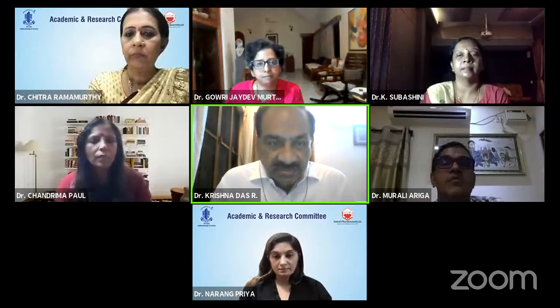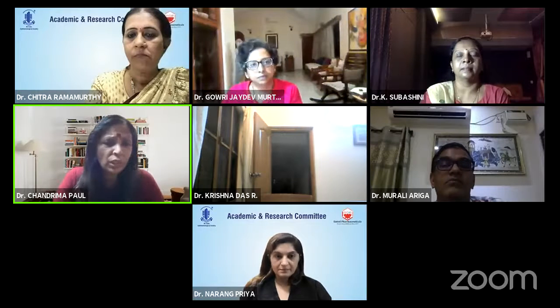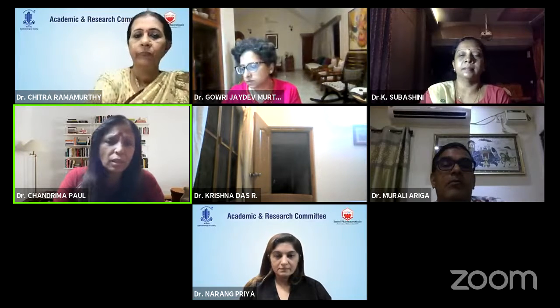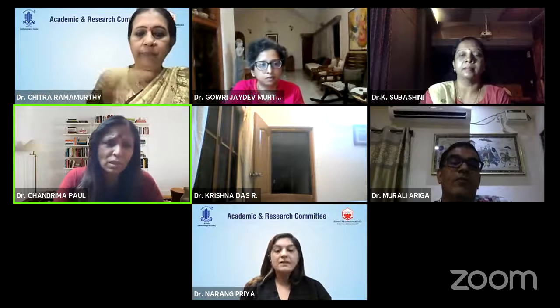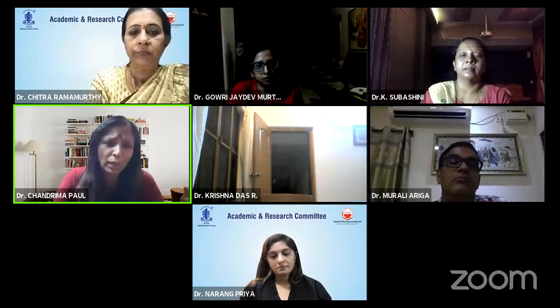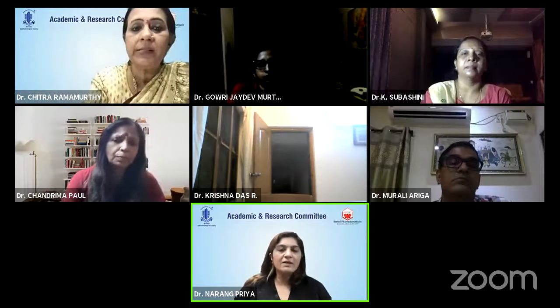Chandrima, you want to say something? Yeah, so wonderful talk and interesting as well. But I suppose for known glaucoma patients, we still need to stick to the Humphrey and the Octopus. Maybe for screening, as of now, we can use this, for example to screen a patient before cataract surgery and see what the field is like. But for known glaucoma patients, we need more evidence-based studies so that we can put this into the protocol as a replacement for Humphrey and the Octopus. Yes, absolutely. Study-based evidence has to be there.